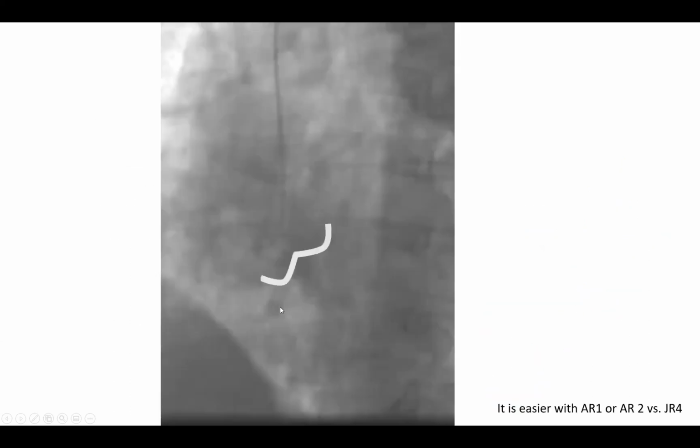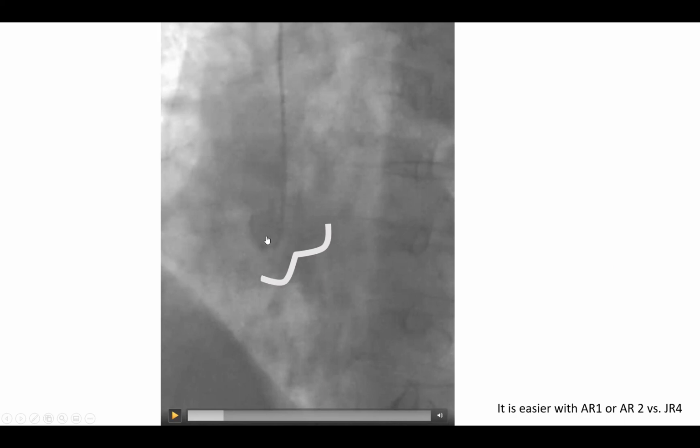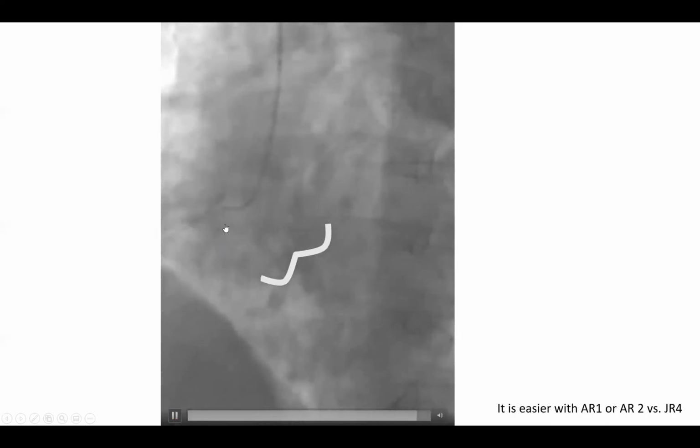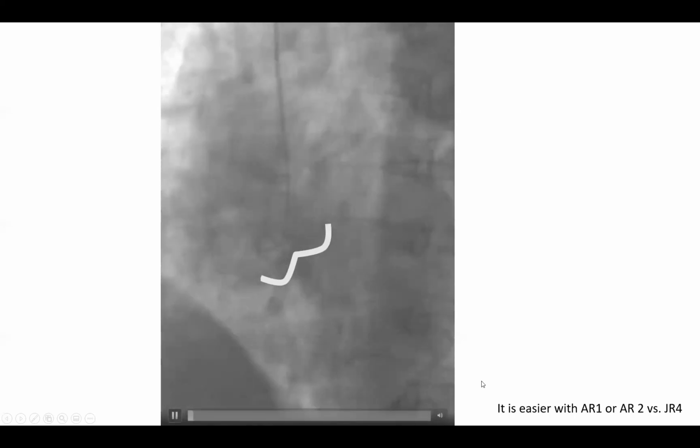And here is an illustration of that. So here again, the fellow used clockwise torque and pulled, and the catheter came in the sinus below the coronary ostium. And on the non-selective puff, you can see that nest, that sinus of Valsalva. So he slightly counterclocked. The catheter is looking at us, then pulled with a clock, and he fell in. You see that? So he did a perfect maneuver here. This is one of our fellows. So counterclock, then pulled with a slight clock, and he got in. Again, practice always imagining those cusps in your brain.